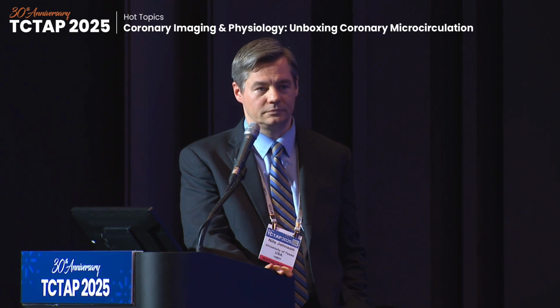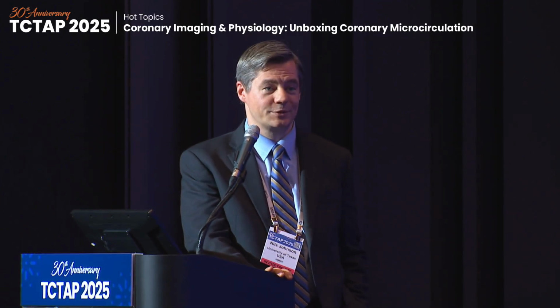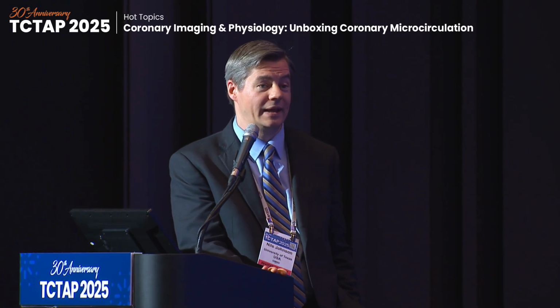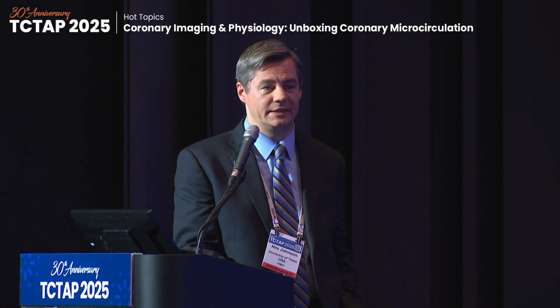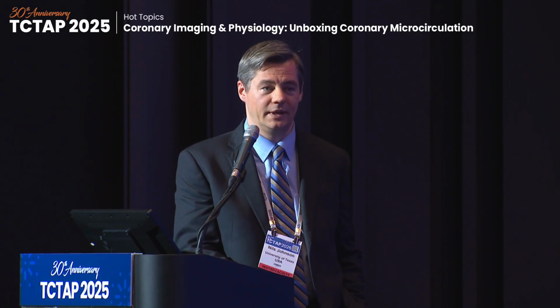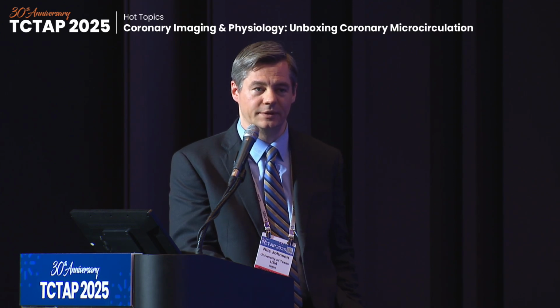How about microvascular spasm? Yeah, you can get a lot of people's coronaries to do what you just saw up on the screen. I think very few of those happen in daily life in patients, although the kind of cases that have been presented here are the kind where that is probably clinically relevant and not just an angiographic effect of giving lots of acetylcholine to people.